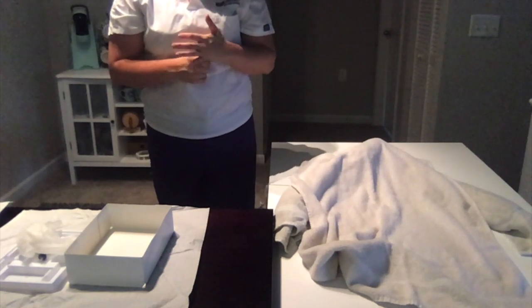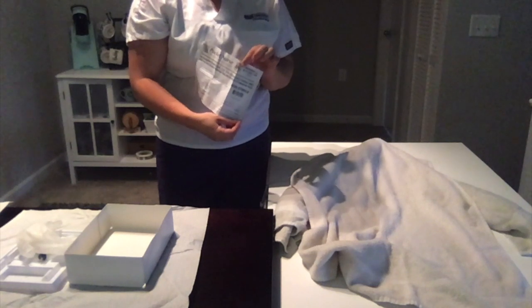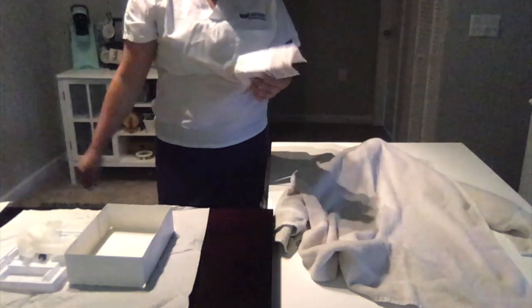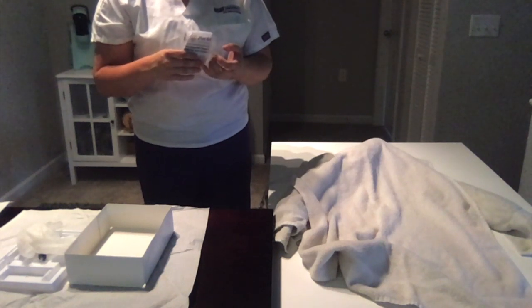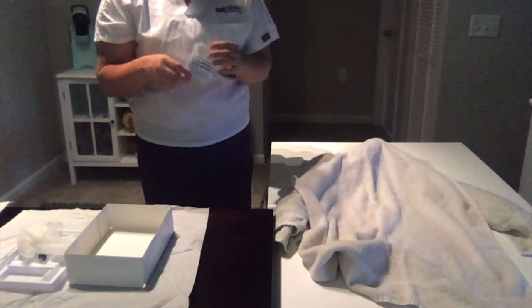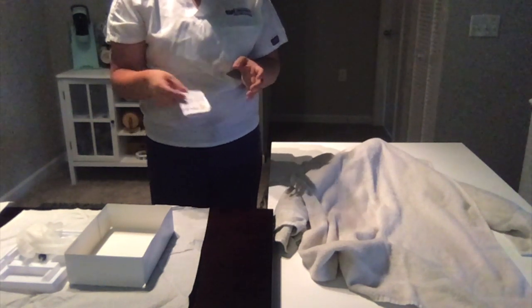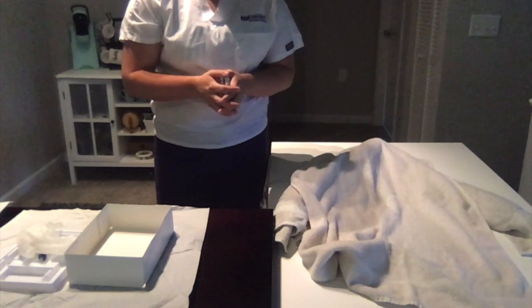Once I do that, I'm going to take out this paper and I'm going to document in my MAR the type and the size of the catheter that we used. I'm going to measure, I'm going to look at the color, amount, consistency, and any odor that was in the patient or that the urine had. And then I'm going to document how well the patient tolerated the procedure. And that's going to be it for catheter insertion.